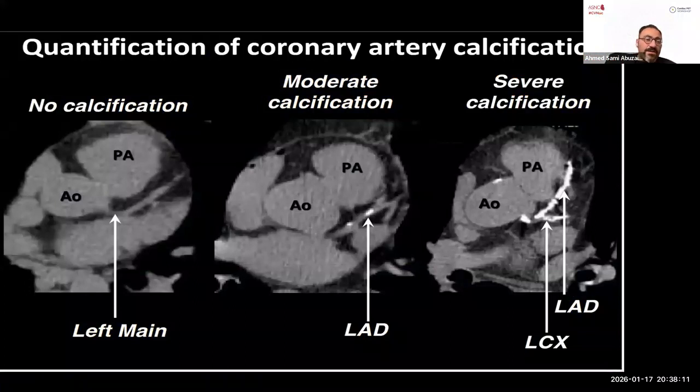If you have a CT scan with the cardiac PET, I can see the blood vessel nicely. I think this is the aorta, this is the PA, this is the left main, and this is the RCA, gonna come here, or the right coronary. So basically we are looking at the blood vessel. I can see here nicely, of course, it's not really high quality. I don't think this is a plaque or non-calcified plaque, but I think we try to see anything white. Anything white, we'll call it. You have no calcium to a mild calcium to moderate, maybe severe calcium. And now we can tell the patient you have anatomical evidence of atherosclerosis and coronary calcification.